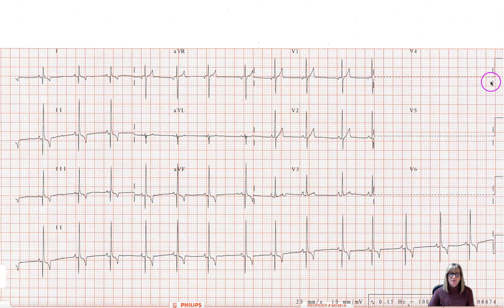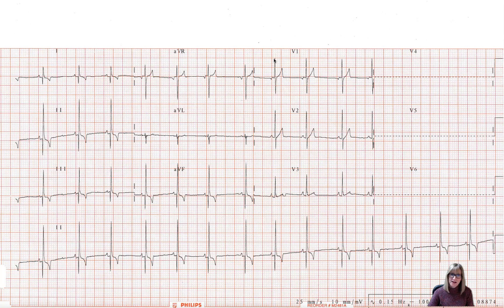The first thing we're going to talk about are the axes for this graphic representation. There's an x-axis or the horizontal axis which is time, and there's a y-axis or the vertical axis which is voltage or amplitude. We need to know the scale of those axes when it comes to doing things like heart rate, for instance.